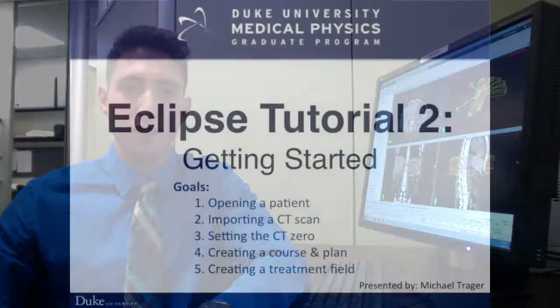In this video series, I will cover the basics of the Eclipse interface, getting started with a treatment plan, contouring strategies, basic 3D planning, IMRT planning, and how to analyze plans. I'll be working with Eclipse version 13.6 and Aria version 13.6. Alright, let's get started.